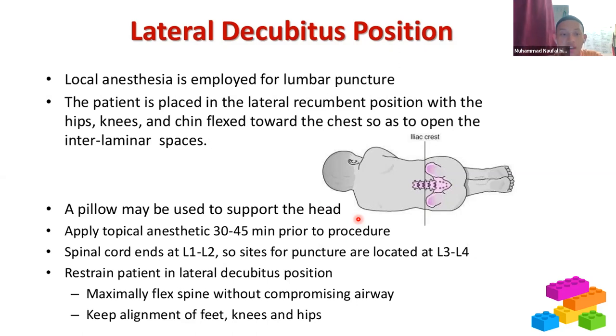It can disrupt the respiratory function. Also, apply a topical anesthetic 30 to 45 minutes prior to the procedure. And like I have said before, the spinal cord ends at L1 and L2 interspace, so the site for puncture is located at L3, L4 interspace.